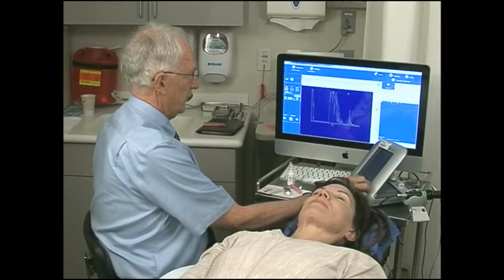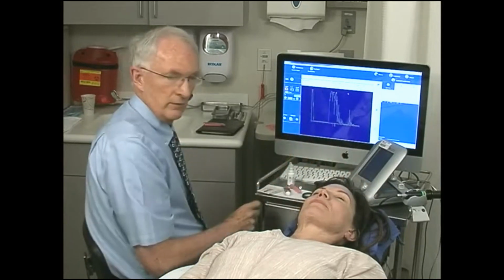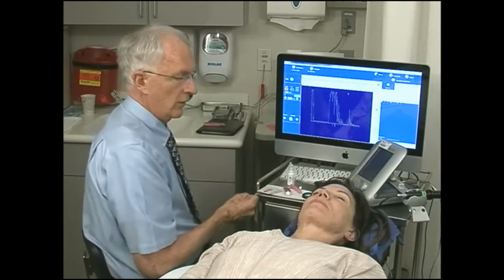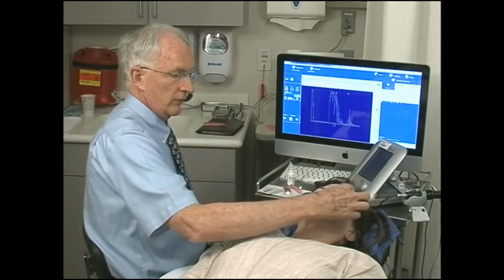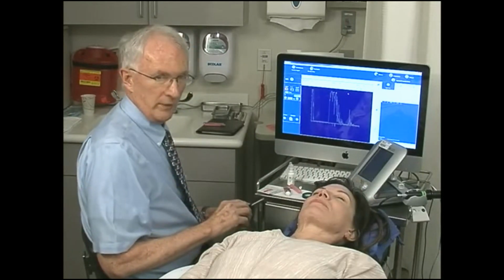So I place the cursor on one sheath of the muscle, the other cursor here, and measure that dimension as 2.79 millimeters. So I've now measured 5 muscles, 1 oblique muscle, 4 rectus muscles. The inferior oblique muscle tends to run inferiorly, kind of in a hammock fashion, across the inferior globe. It's very hard to display that muscle.